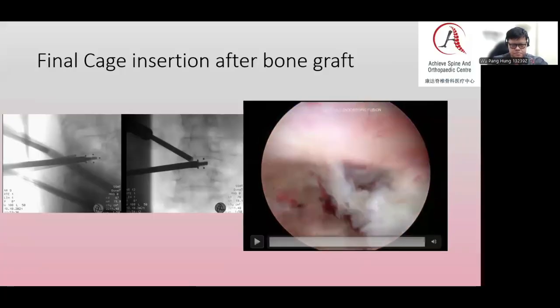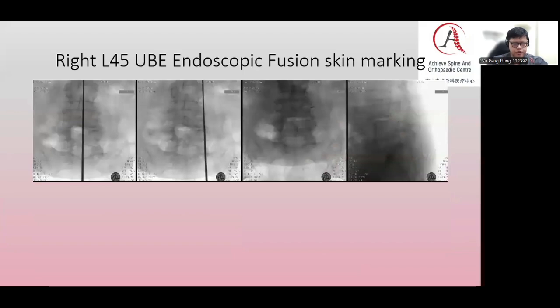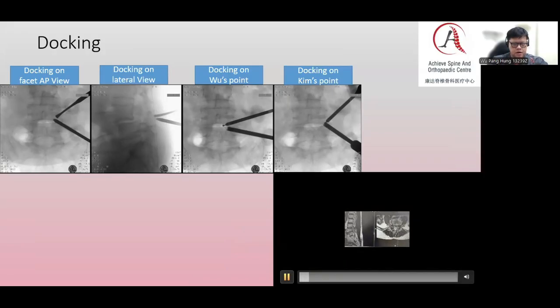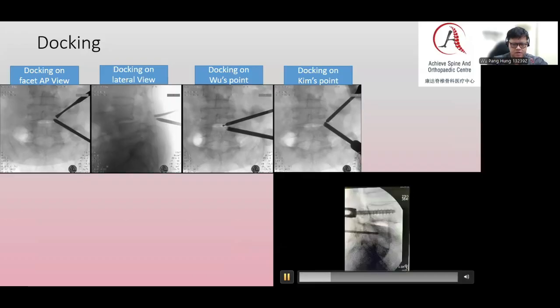So these are the II images for the instrumentation with the percutaneous pedicle screws. It can be done with X-ray or O-arm. For the right side, we also use the pedicle as the landmark. Typically, we will be using slightly lower ports than on the left. The main aim is that on the right-hand side, we'll have a direct trajectory to guide the cage in, as you can see from this case video running.